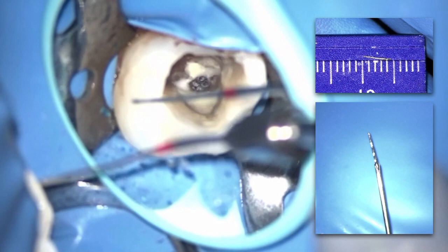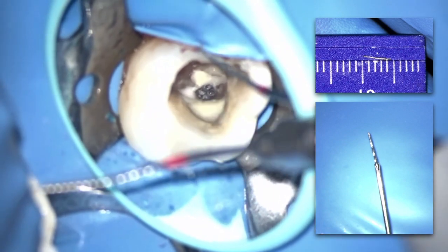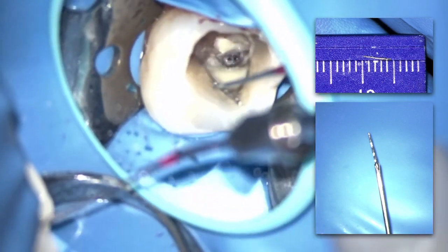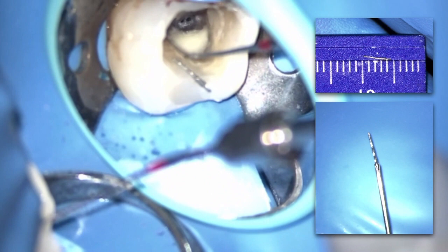Then I jump to the other point, which is the removal of the separated file. After I do sealing of the perforated side, I just touch or trough a little bit around the file. I remove it. Without the dental operating microscope, it's not easy to remove the separated file. Even in the coronal part, maybe with the loupe it's possible, but absolutely in the middle and the apical part it's not possible. But with the coronal part, there is still the other point, which is precision work. Maybe without the dental operating microscope, we are doing another perforation.